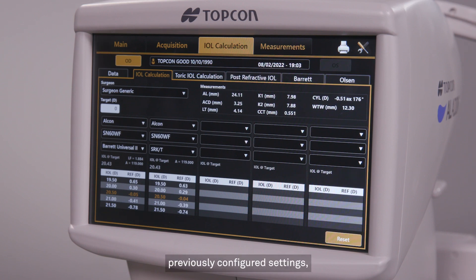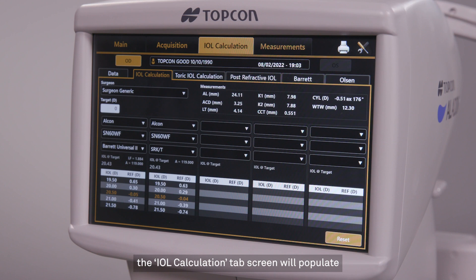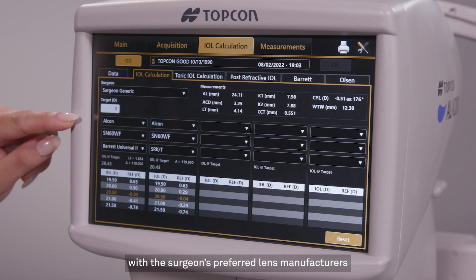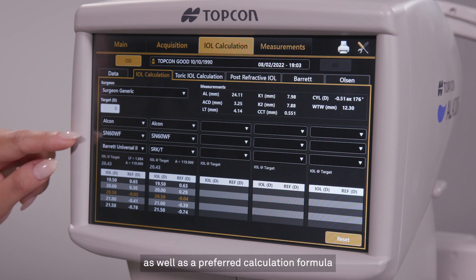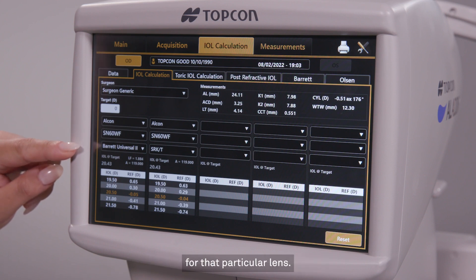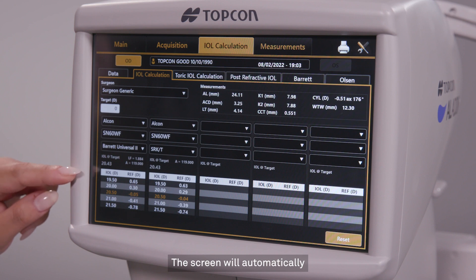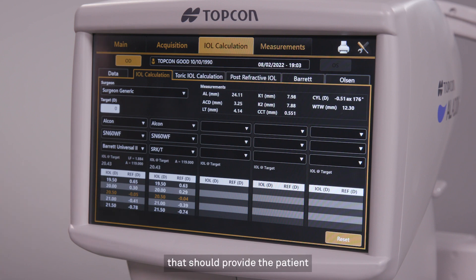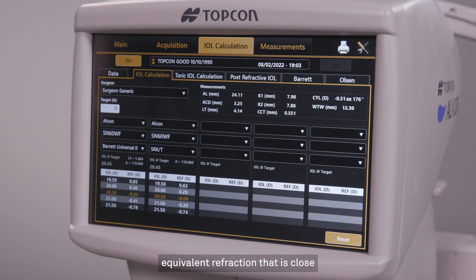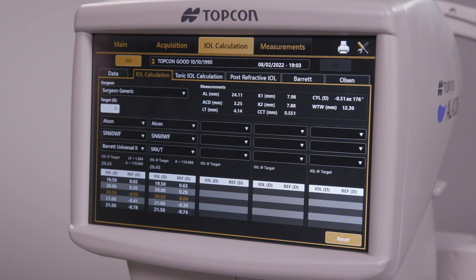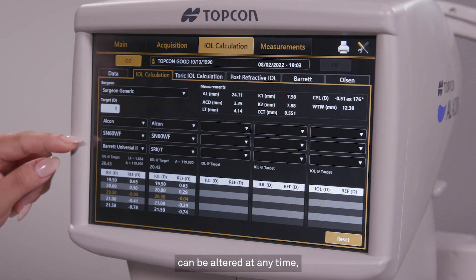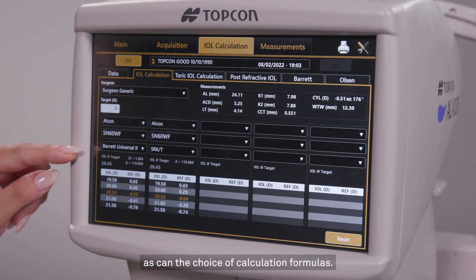Based on your practice's previously configured settings, the IOL calculation tab screen will populate with the surgeon's preferred lens manufacturers and models, as well as a preferred calculation formula for that particular lens. The screen will automatically provide a range of intraocular powers that should provide the patient with a postoperative spherical equivalent refraction that is close to what was entered in the target refraction box. Note that the lens manufacturer and model can be altered at any time, as can the choice of calculation formulas.